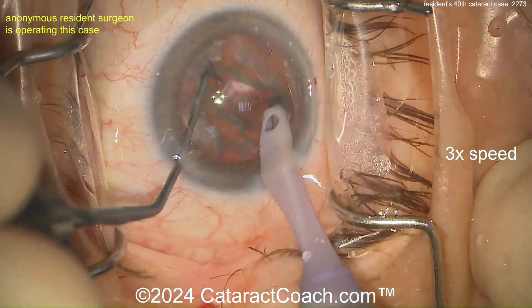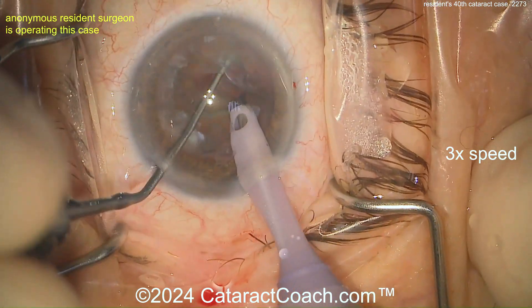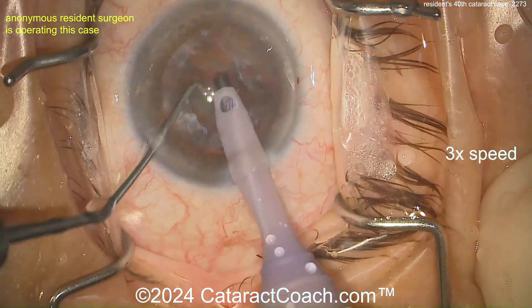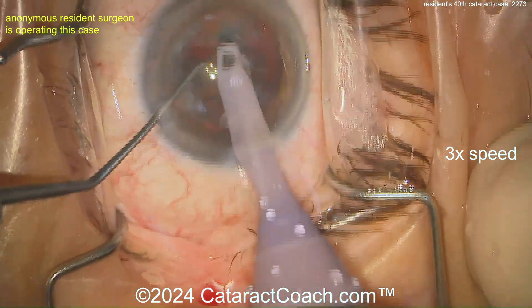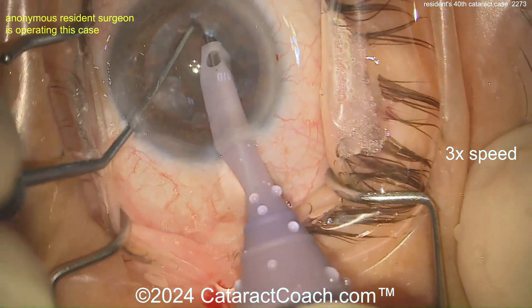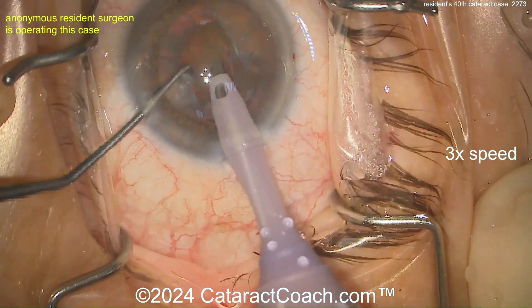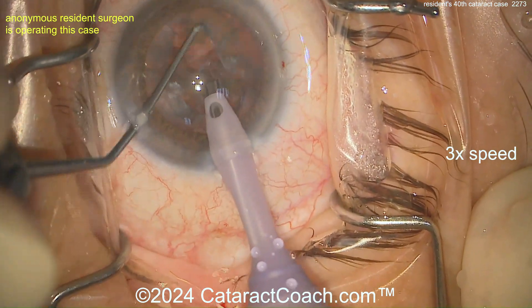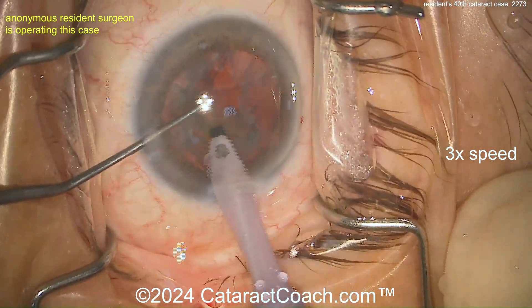Stop-and-chop for case 40 — I actually like it, that's pretty darn good. Getting it rotated — maybe grooving again. All right, divide and conquer. Divide and conquer is pretty typical for case 40, and that's perfectly fine. Divide and conquer is a great technique too. I want you to learn all the techniques. I may love one technique more than another, but I still want you to learn all of them.